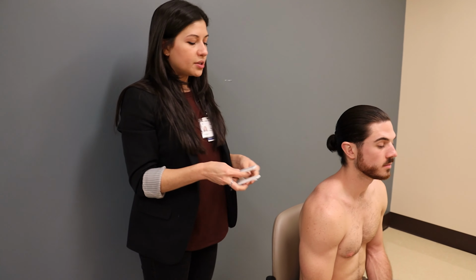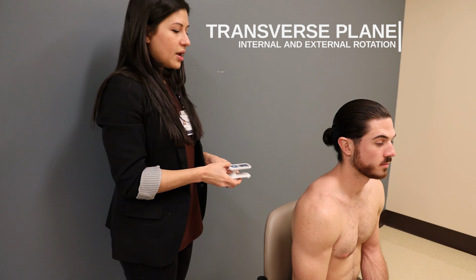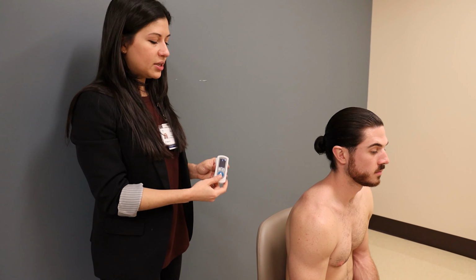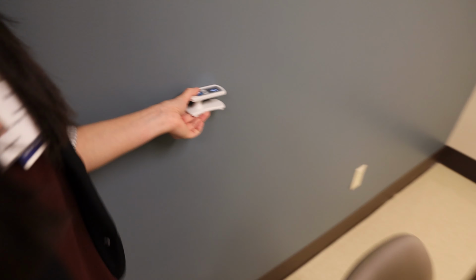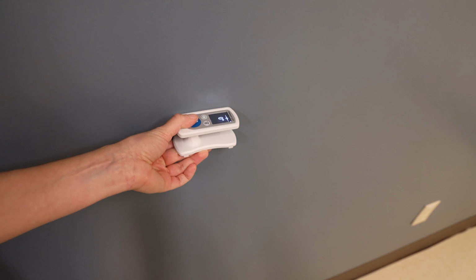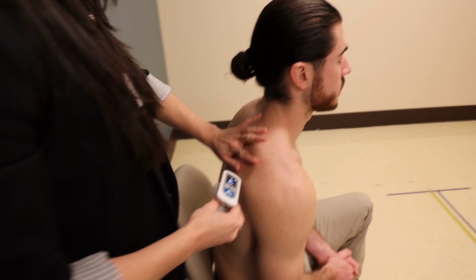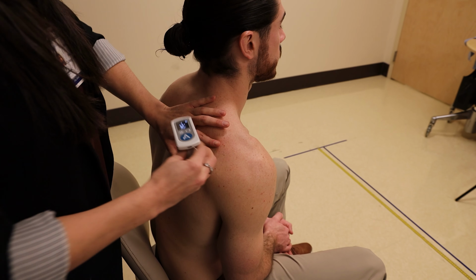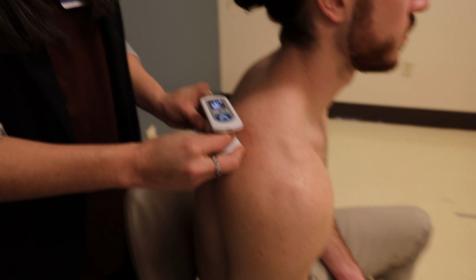Now we'll do the transverse plane. So that's when the scapula goes into internal external rotation. And to calibrate the Easyangle for this one, make sure that it's back to blinking 0. We're gonna come to the wall and we're gonna set it in this horizontal position. And then we'll click the A button to make sure it's at 0. We're gonna come back over to the spine of the scapula, that bony area right there. And then we're gonna use this bottom peg to come in contact with the spine of the scapula.